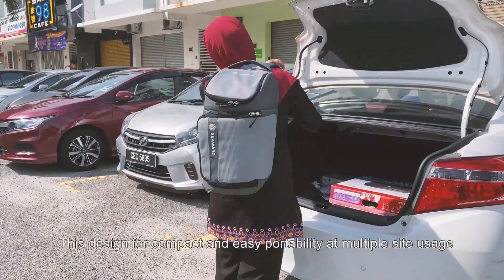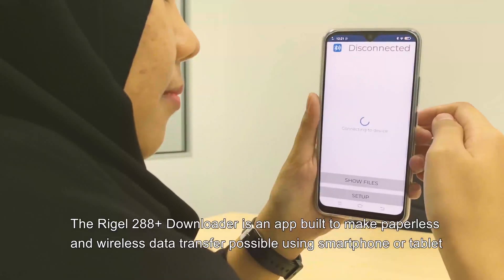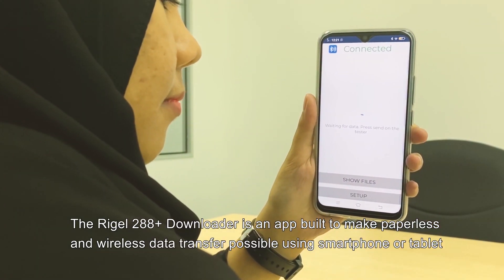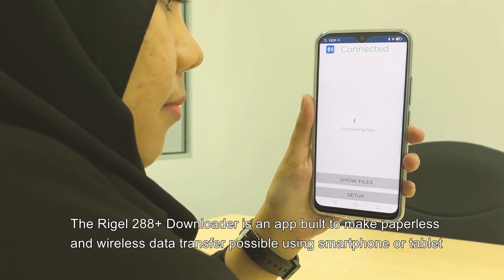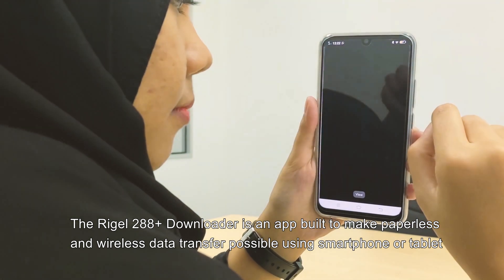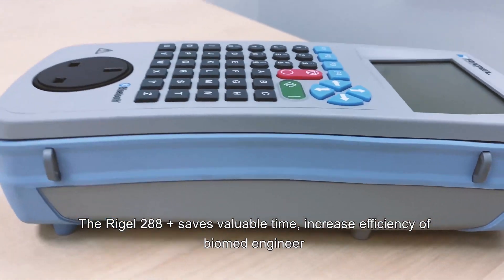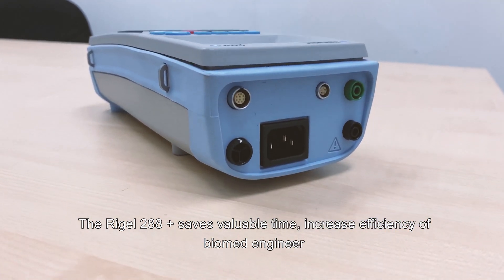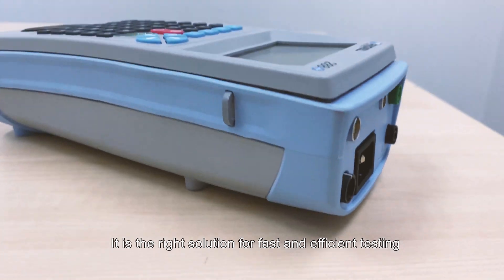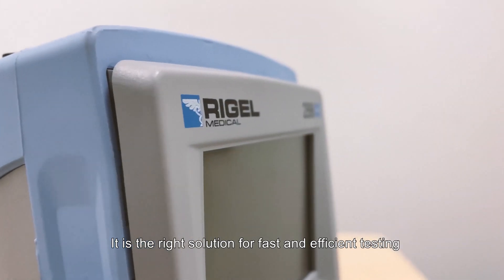Designed for compact and easy portability at multiple site usage, the Rigel 288 Plus Downloader is an app built to make paperless and wireless data transfer possible using a smartphone or tablet. The Rigel 288 Plus saves valuable time and increases the efficiency of a biomedical engineer — it is the right solution for faster and more efficient testing.